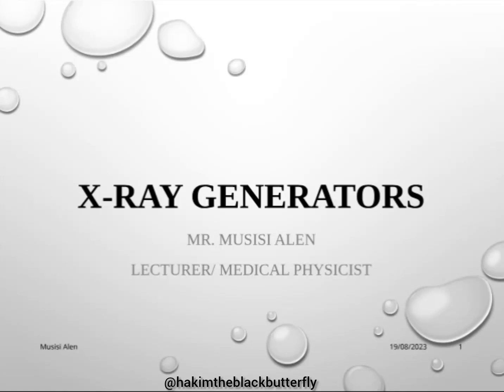We saw that the X-ray tube produced, and we looked at different components in there and their functions. But for those components to work, there must be an X-ray generator. The X-ray generator works as the power supply for the X-ray tube.